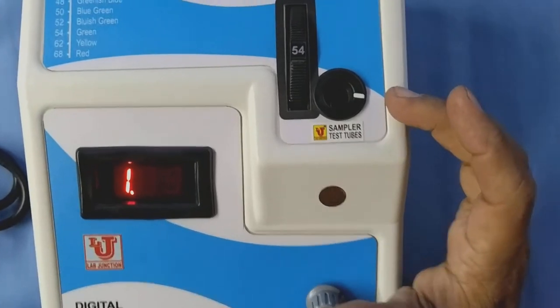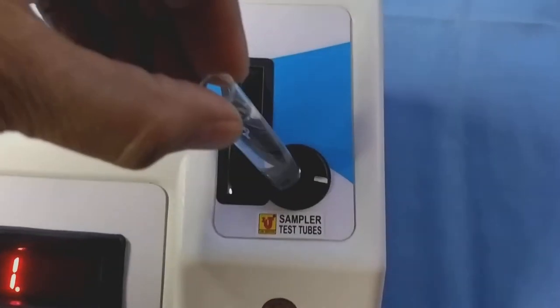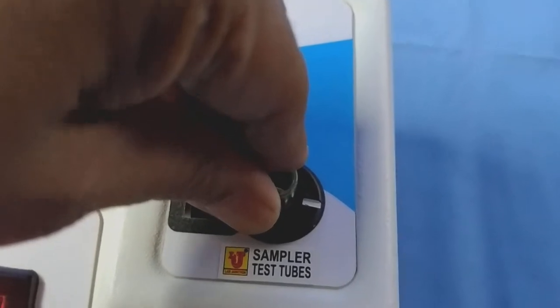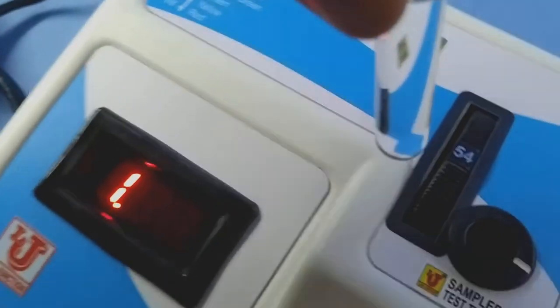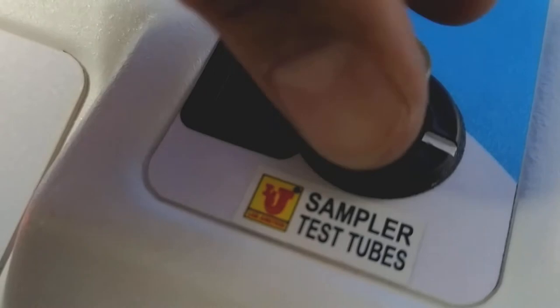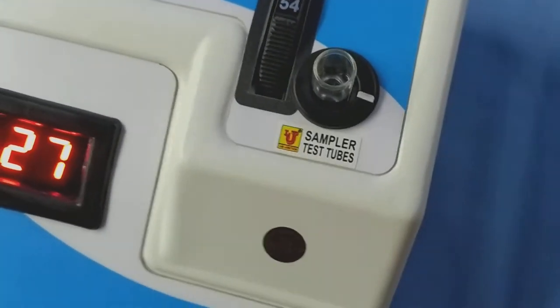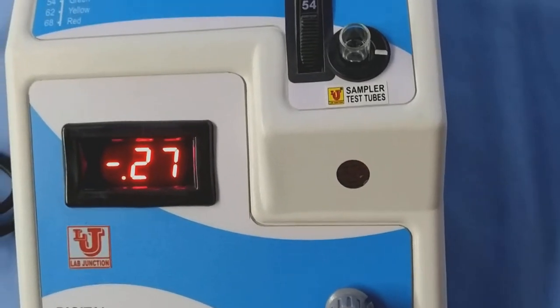This is the sampler for test tubes. Now first insert your blank in the test tube holder like this. You coincide this mark with this mark like this, and properly insert, and set 0.00 from the set OD knob.